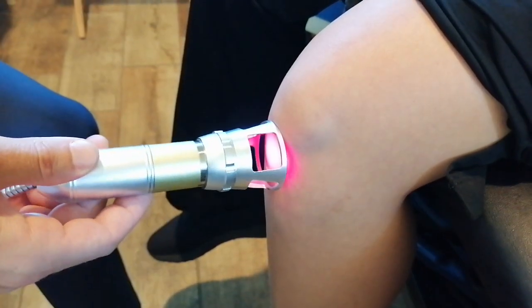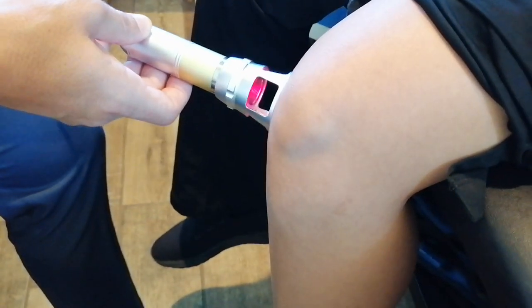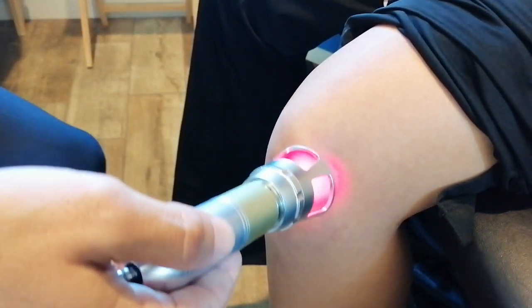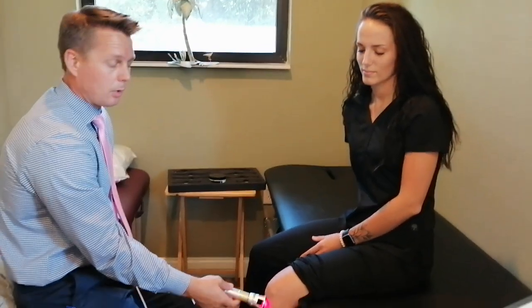This is good for torn meniscus, it's good for arthritis in the knees, and it's good for athletes — if you look up a lot of athletes, they use laser treatment quite a bit. It'll speed up everything from a sprained ankle to golfer's elbow, tennis elbow, and plantar fasciitis. All those things respond really well to cold laser.